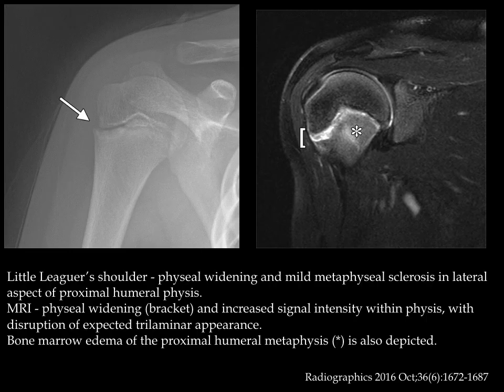Here is another fairly common injury in pediatrics — this is little league shoulder. We can see asymmetrical widening of the proximal humerus laterally and some sclerosis along the physis. On MRI we also see widening of the growth plate as well as some bone marrow edema in the proximal metaphysis.